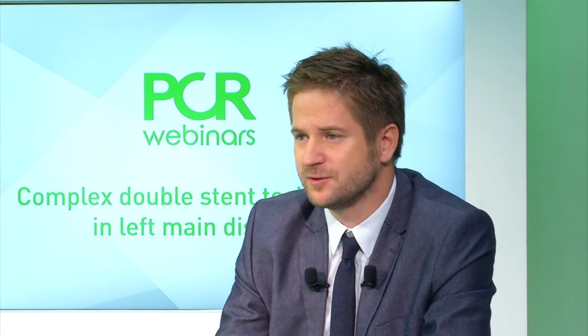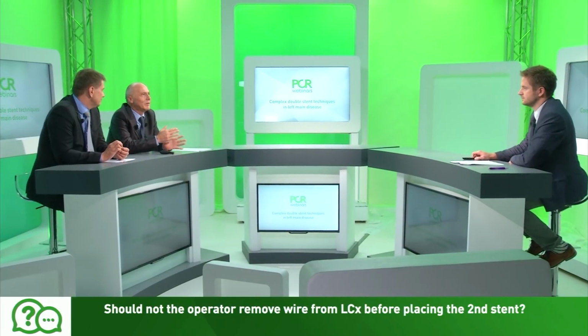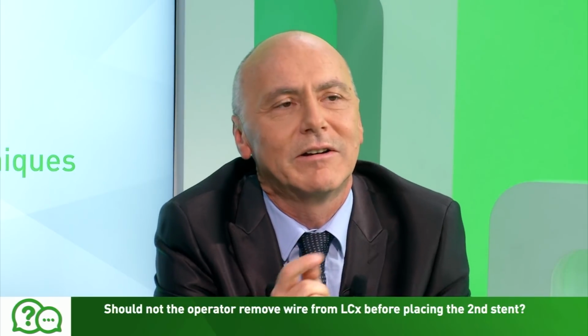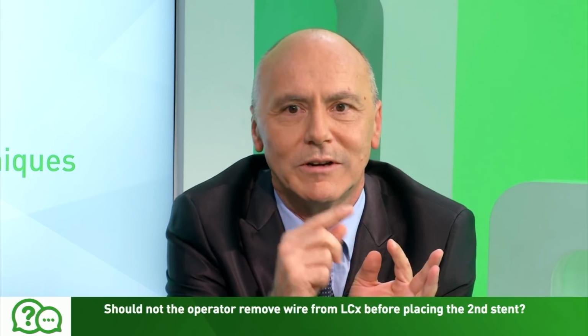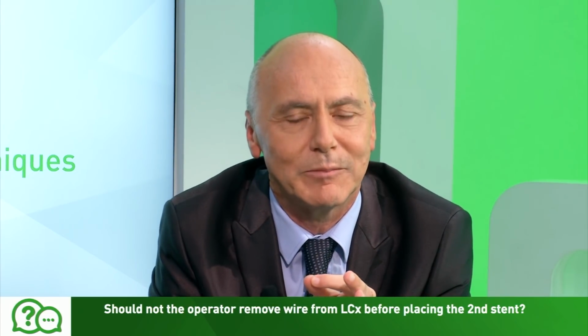Let's phrase it this way: what is the risk if you leave your wire in place, and what is the risk if you remove your wire prior to stenting? To leave the wire behind, you risk that you cannot get it out or you can break it. That's a theoretical risk, which fortunately has never happened to me so far. Maybe if the vessel were very calcified and you go high pressure, then probably this would be a danger, in particular if you have the black part of the wire trapped. I think that's very important, that you don't get the black part of the wire trapped.